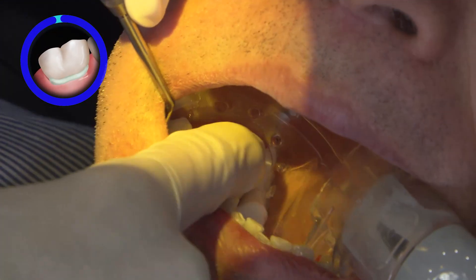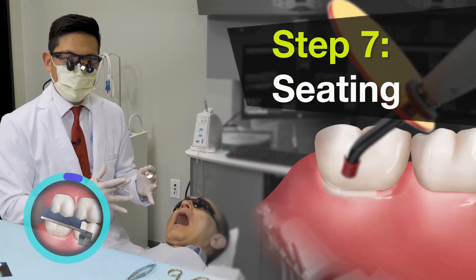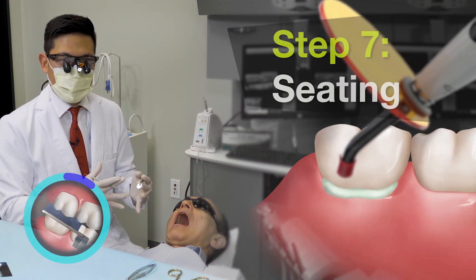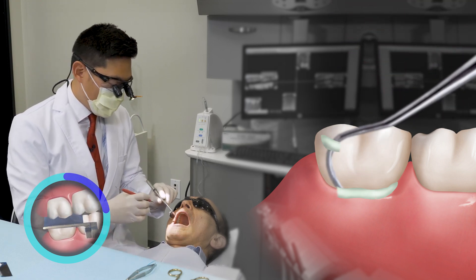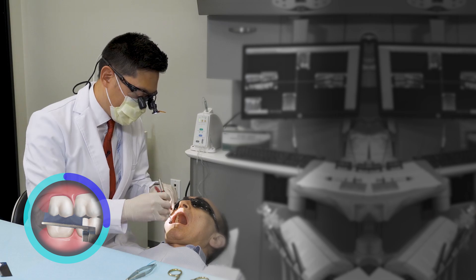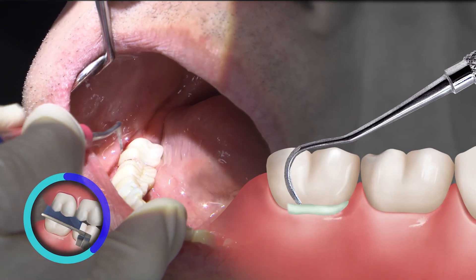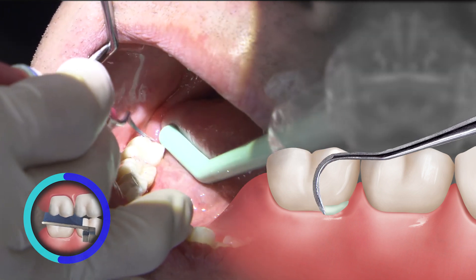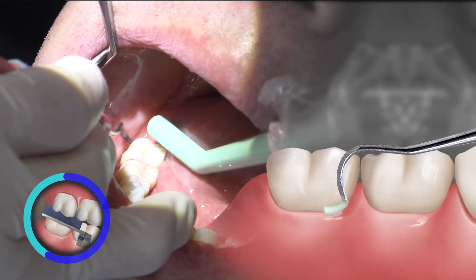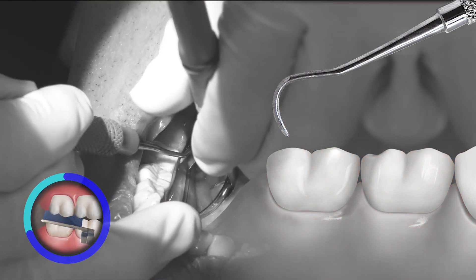We'll do the same thing on the buccal there. We finish off with the removal of excess cement after we've secured everything in place and light cured — now I can feel more comfortable removing any areas of excess cement. Using a scaler along the buccal and certainly all of the margins, just to make sure that all of the margins and proximal surfaces are free of any excess cement.